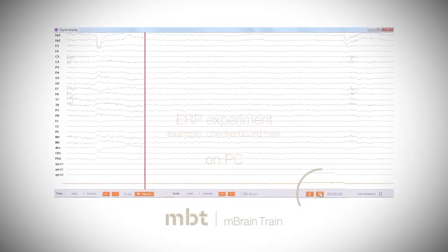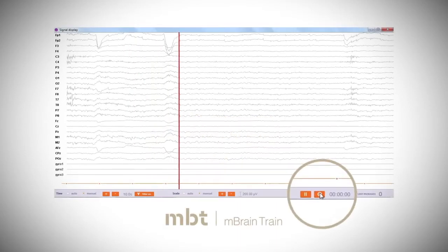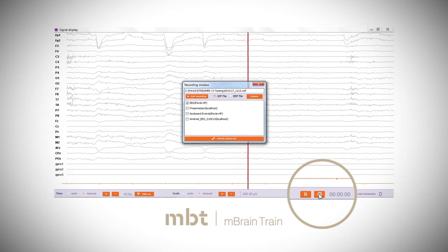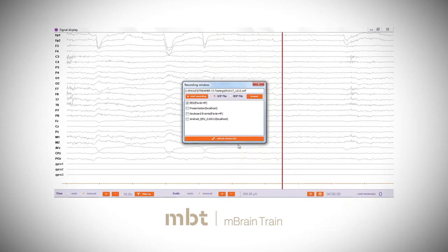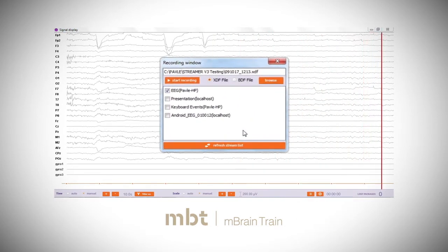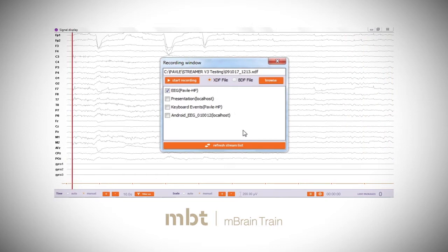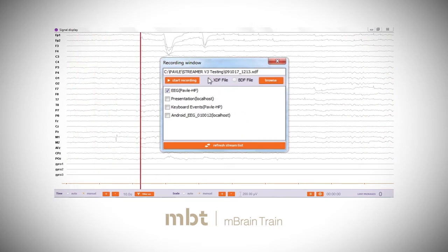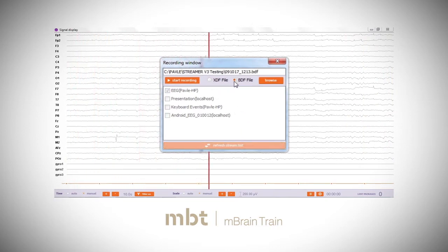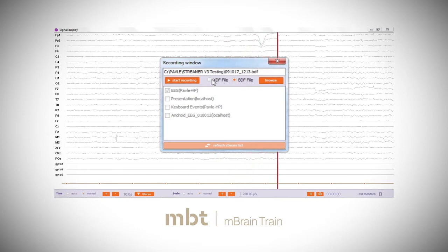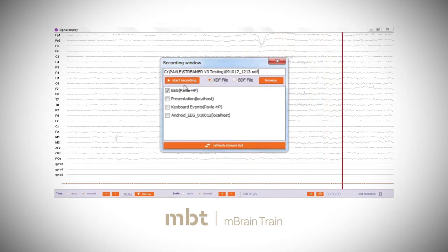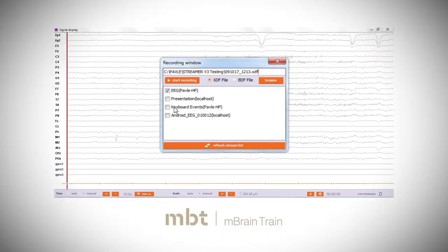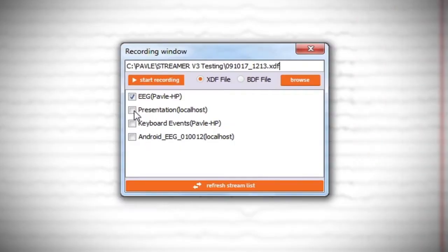Click the record button in Smarting Streamer signal display window. For a presentation experiment, select the XDF file format. If sending the event codes over the UDP protocol, select the BDF format. Click the boxes of the streams you want to record, in this case EEG and presentation.